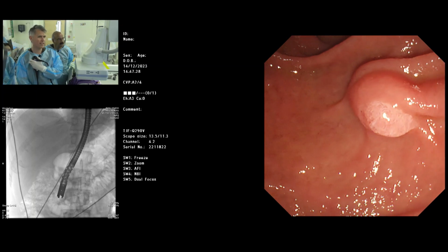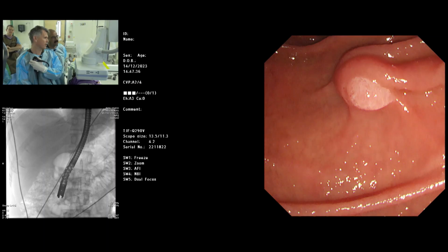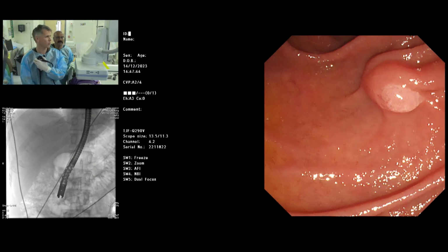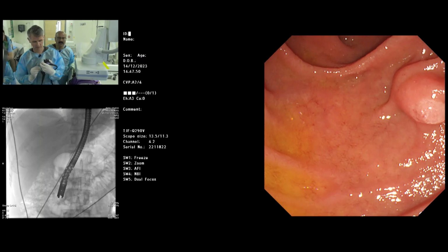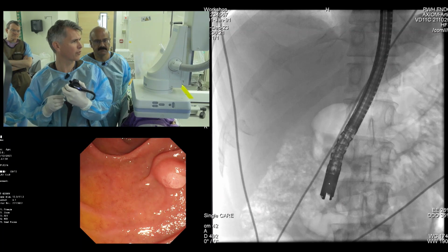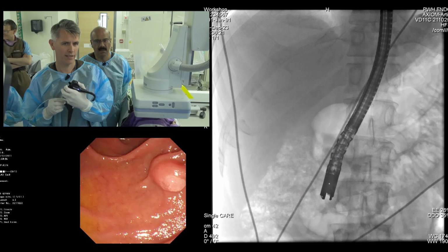So we were discussing if we could see a radiopaque stone here, and we might see this stone in front of the spine. Maybe you can see it on the X-ray overview as well. Are you getting the fluoroscopy picture? If you're getting the fluoroscopy picture, you can probably see that shadow there, which appears to be on the spine. So in front of the spine, maybe it's there. So it will be difficult. It's a little bit weak for us.